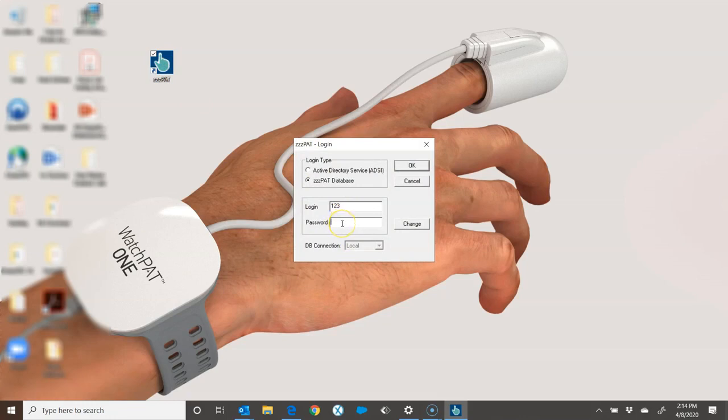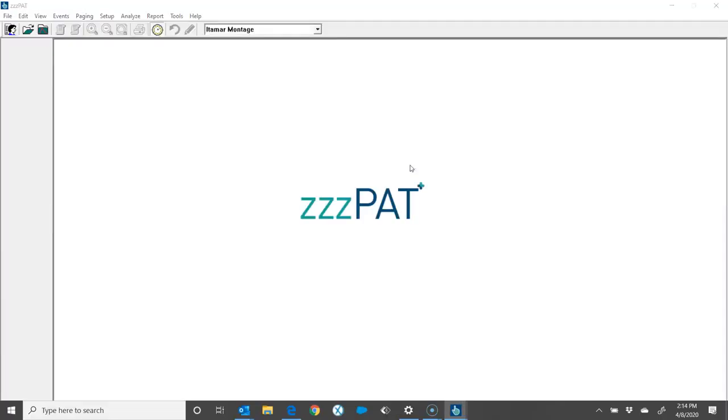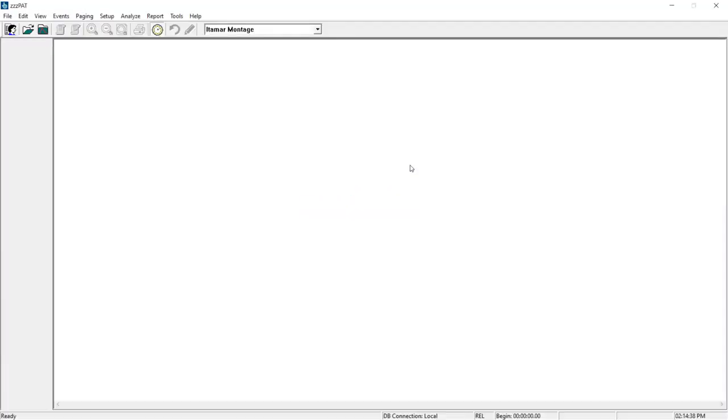There should be a login and a sign-in password. Fill those out and click on OK. Once the program fully loads, I'll go up to the top left-hand corner and click on the open folder.